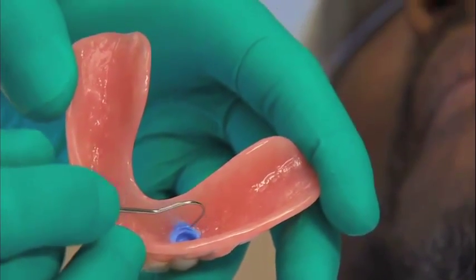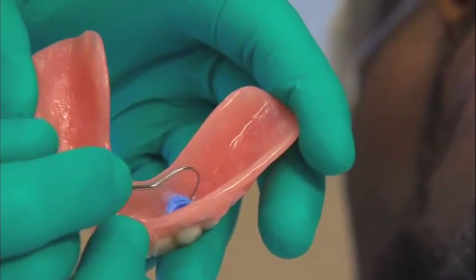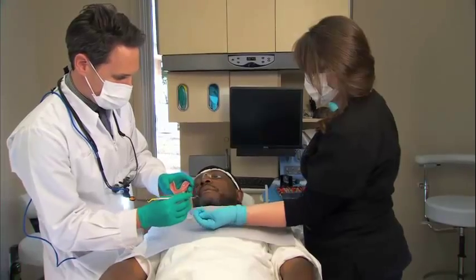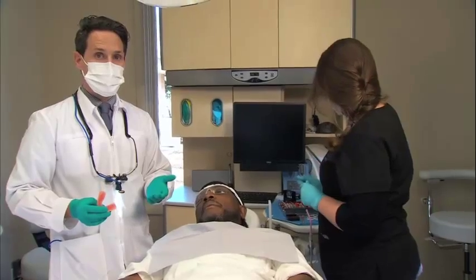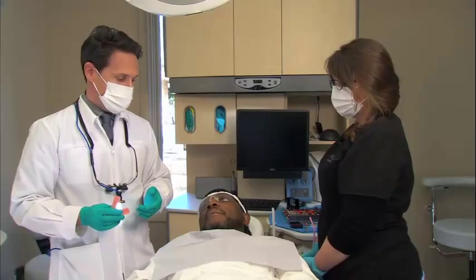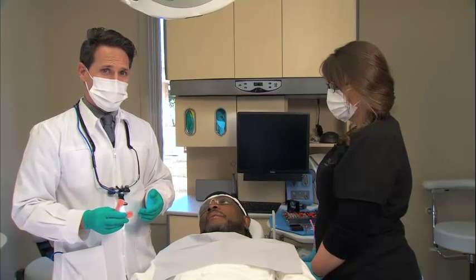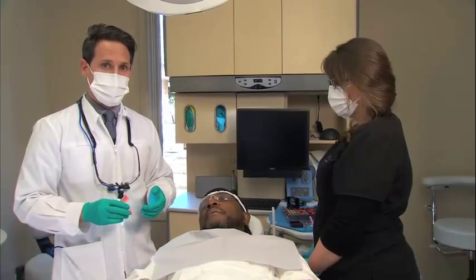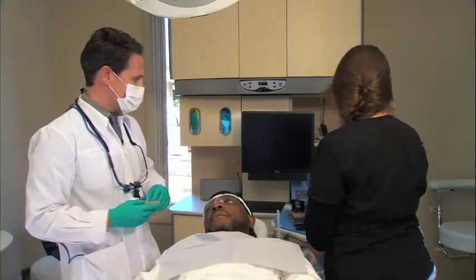This stuff comes out fairly easily — all I have here is just an explorer and it's going to pop right out. Now that we know we have enough clearance, one of the biggest fears as a dentist is having the denture locked onto the implant. We can use the Fit Test CNB around the attachment to seal up the area between the implant and the attachment so no material flows there.